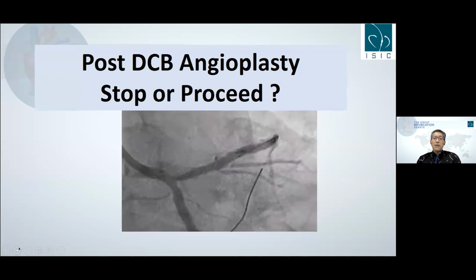But if there is some plaque burden here, even if the stent is fully expanded, then we have to remove that plaque burden, or we have to compress that plaque burden. So which way is better for this region? To decide which is better, I strongly recommend using the OCT or IVUS again in this region.